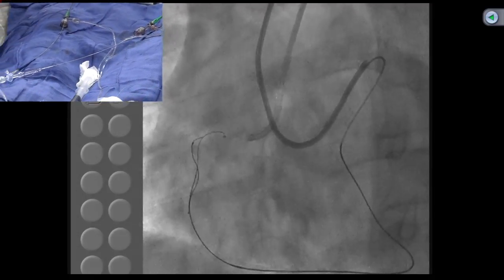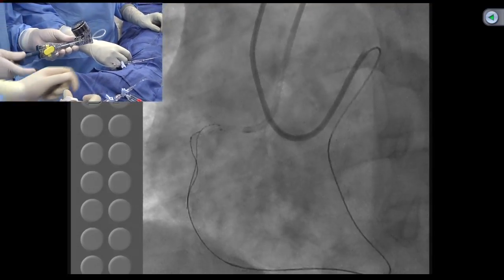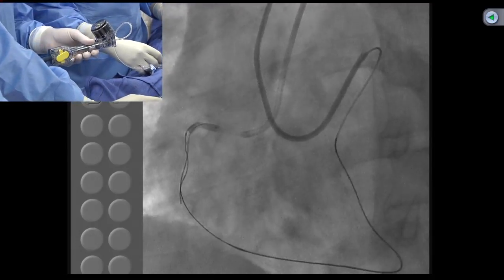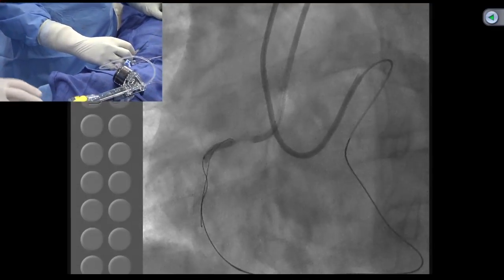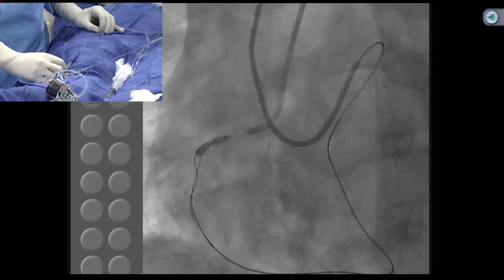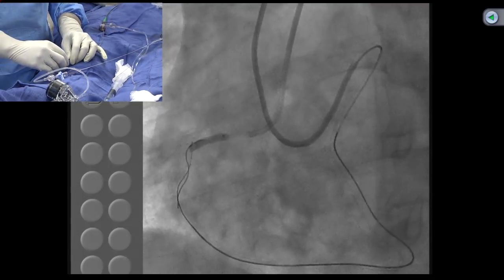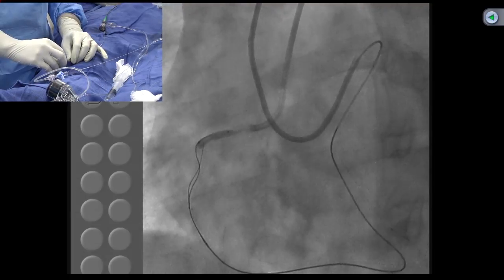It's basically a reverse referral from the surgeon, because they know the confidence level, that those kinds of cases we should be able to do routinely. Look, that is really the complete aim of a heart team. People work in collaborative fashion. Surgeons come to know exactly where we do a better job, and we hold the same healthy respect for them. That's it. Now, Anu, tell us your steps now.